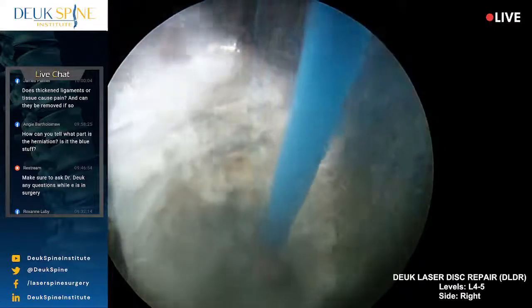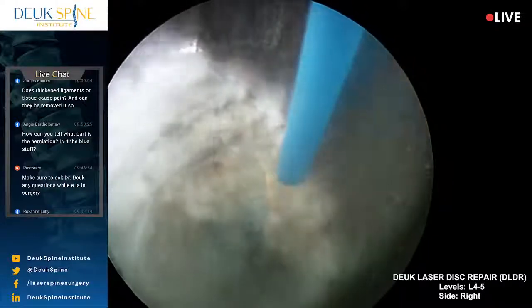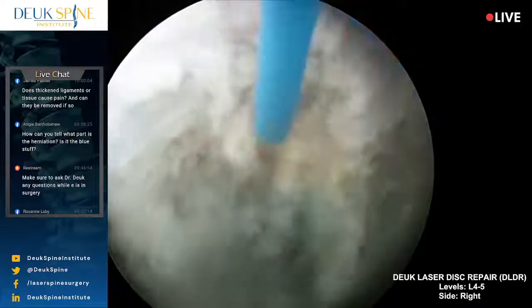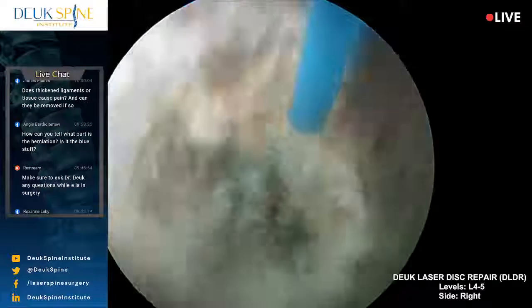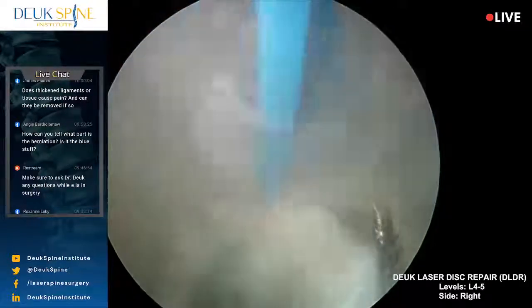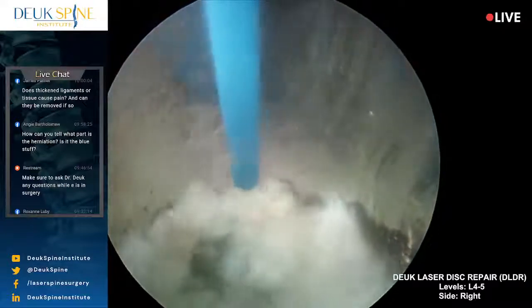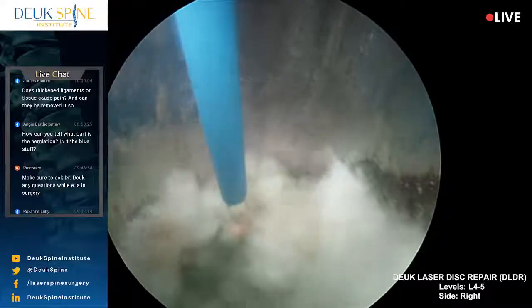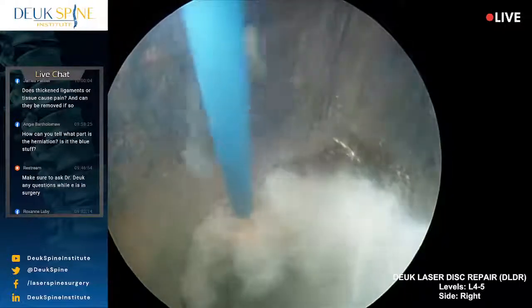I need 1 more minute. We're done. We'll go ahead and use an antiseptic, irrigate the wound. I want to look lateral again. Once again, the tear always extends medial to lateral. And so I have to look backwards in the tube, clean it up so it doesn't re-herniate.